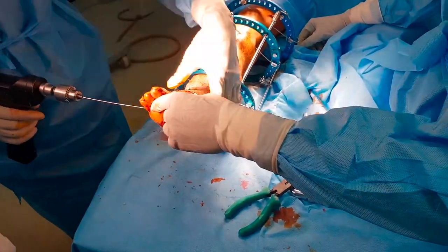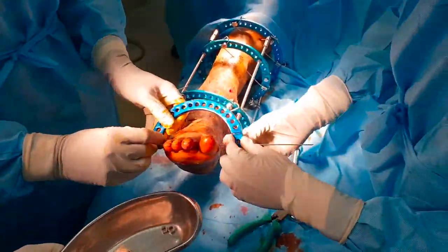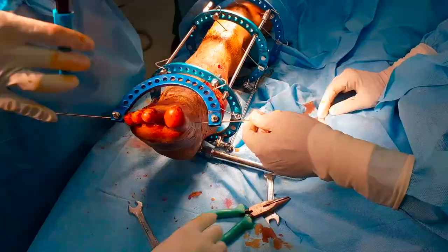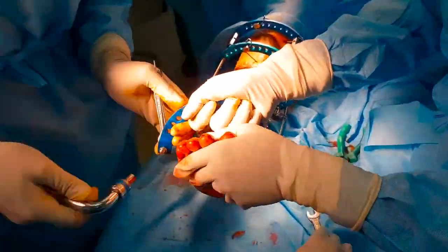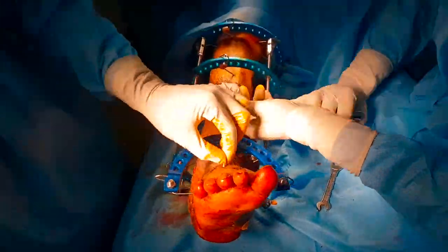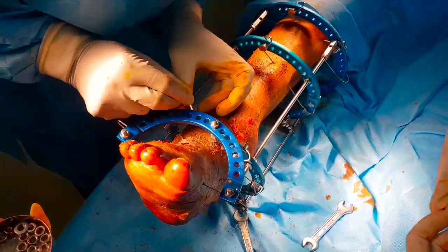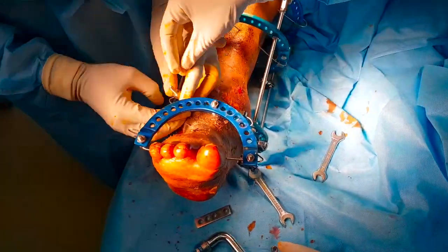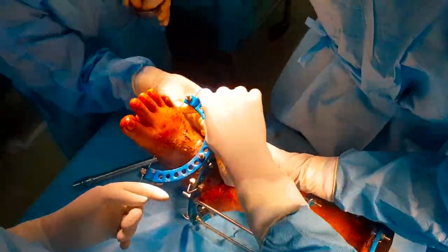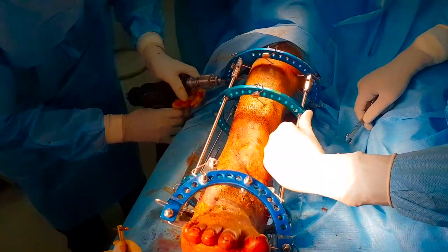The next wire is a metatarsal wire which starts from the fifth metatarsal to the first, and over this a half ring is passed. The tension for a half ring should be lesser than the tension for a full ring. The metatarsal is stretched to 90 degrees to ensure that the patient has a plantigrade foot for weight-bearing walking from the next post-operative day. The metatarsal ring can be kept at right angle to the distal tibial ring using paired posts or a combination of a post and a straight plate.